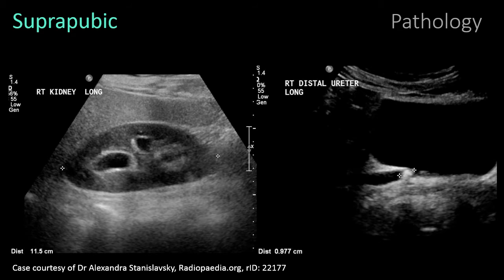So you could have started at the bladder or you could have started at the kidney, but either way you would have gotten some clue that there's an increased pressure in the ureter.